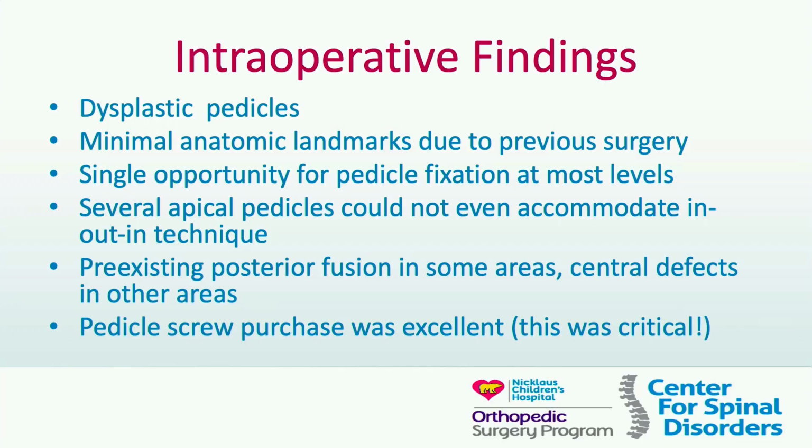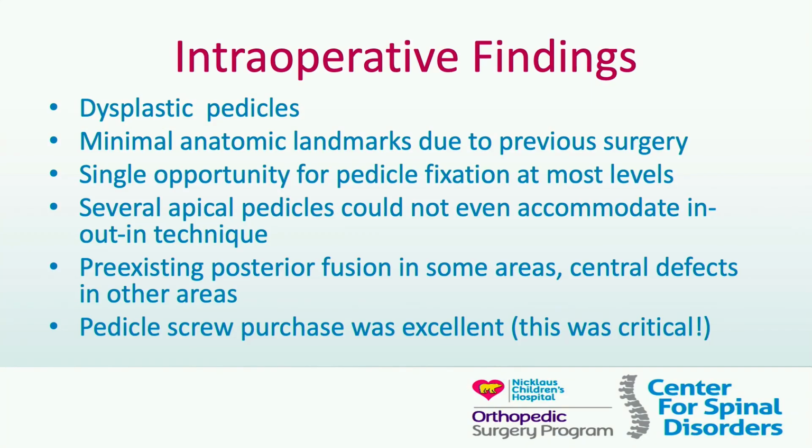Some of the things that we were really surprised about and very happy to see is that we were able to get good pedicle screw fixation, and that was on the first try. And as many of you know, when you start placing pedicle screws in suboptimal pedicles, sometimes it's not the first try or second try, but maybe the third try. And then you have to be honest with yourself. Okay, I have the screw in there now on the third try, but what can I do with it? It's there, but can you really do much with that anchor point? And I would say that oftentimes you can't do much. So getting it on the first try, predictably, was critical.